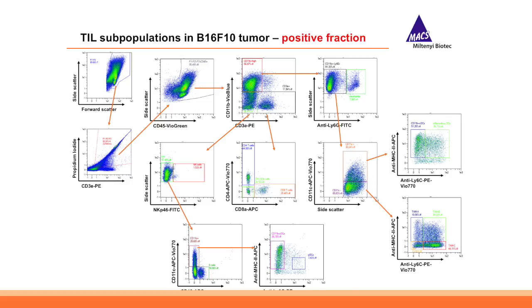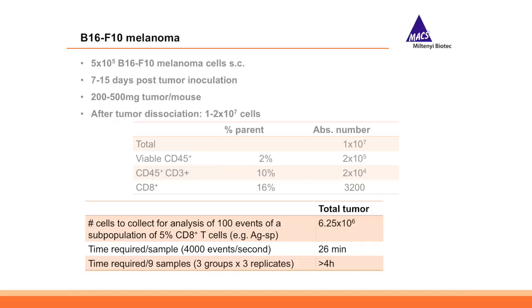So if we go back to the same type of analysis in the beginning, it translates into significant time savings if the number of cells of interest is kept constant. So we can either take 4 hours for our complete analysis of 100 events, or down to 5 minutes.